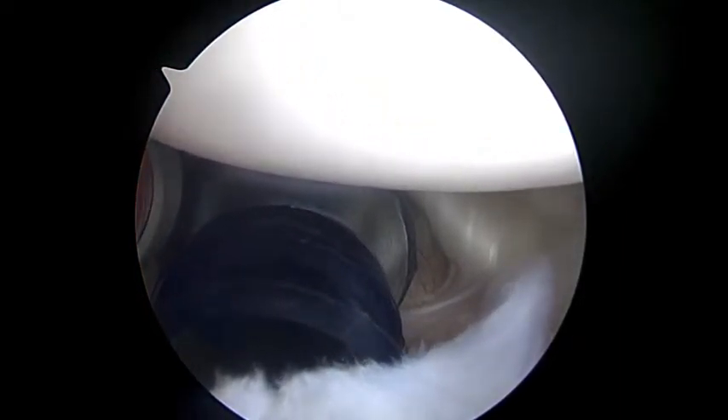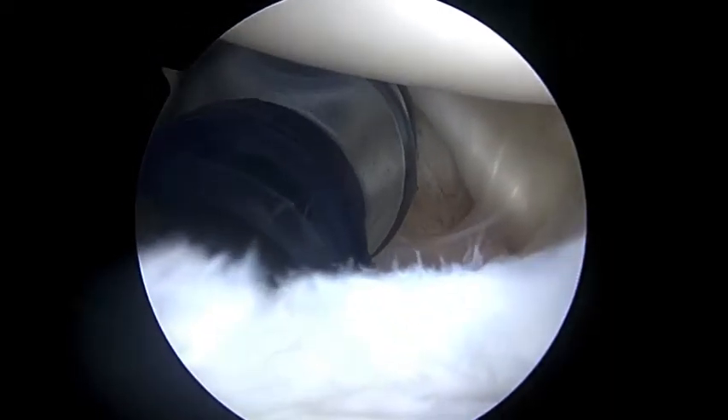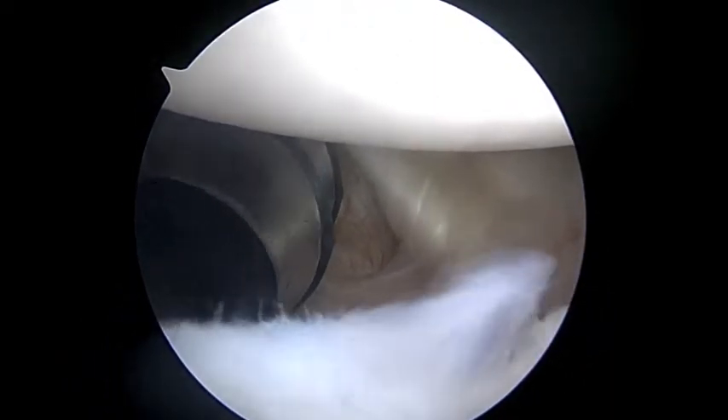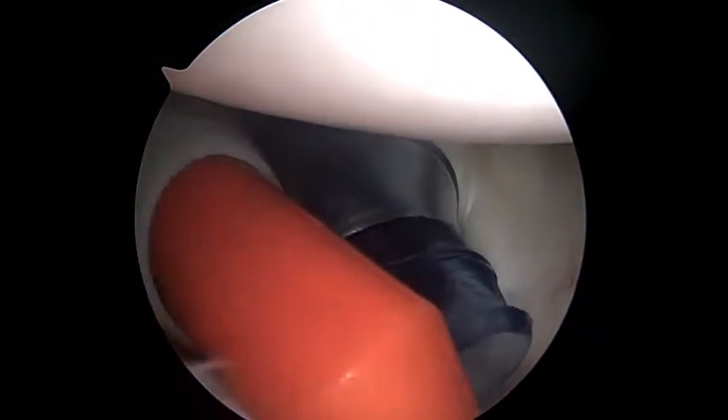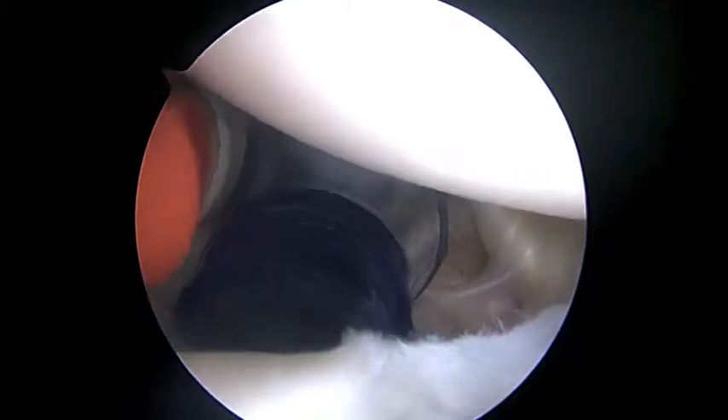Hi Russ, it's Dr. Buford. We're just getting started on the right shoulder. We examined your shoulder before we started and there was a lot of instability, both anterior and posterior, so we know we're going to have to really do a lot to stabilize the shoulder here.